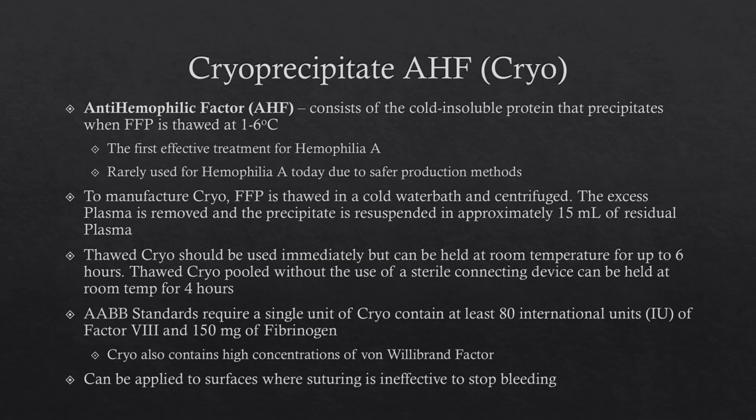When it's time to be used, a cryo unit should be thawed in a warm water bath, and then it needs to be transfused immediately. If not immediately, then it can be held at room temperature for up to 6 hours, unless it was pooled. If you pooled your plasma or your cryoprecipitate and you did not use a sterile connecting device, then you've got just a 4-hour out date. Any room temperature product that's become an open system automatically gets a 4-hour expiration time.